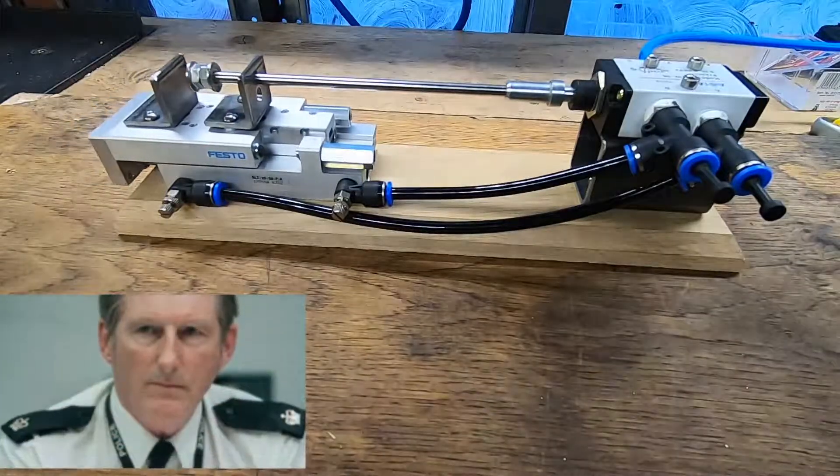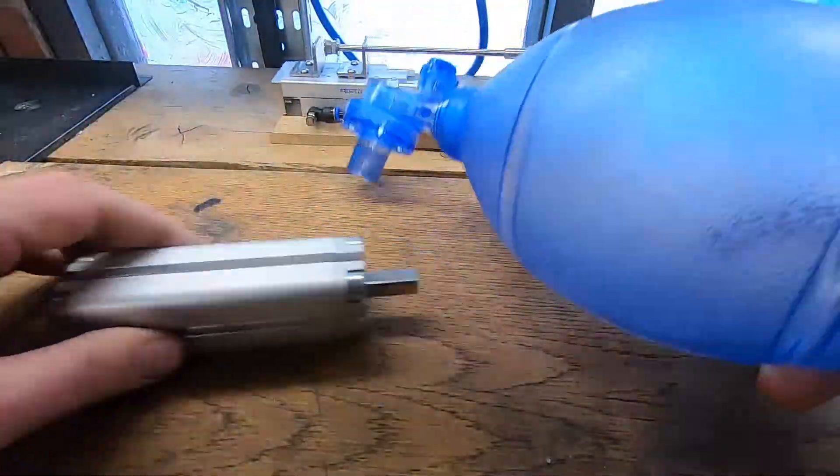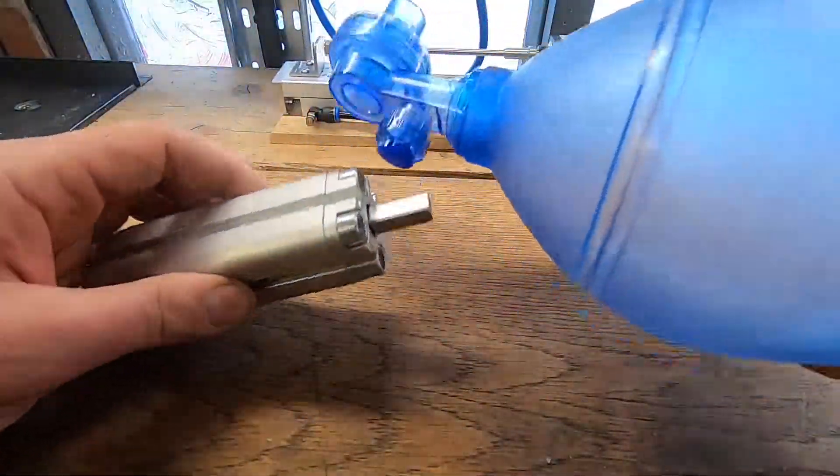Next up we're going to make a cradle and a frame to hold these two.